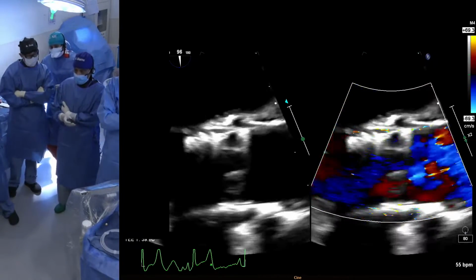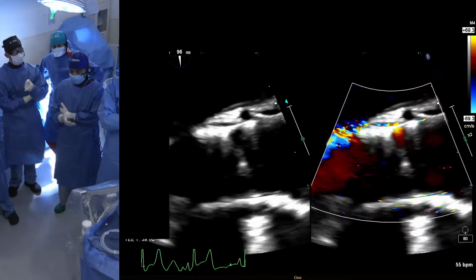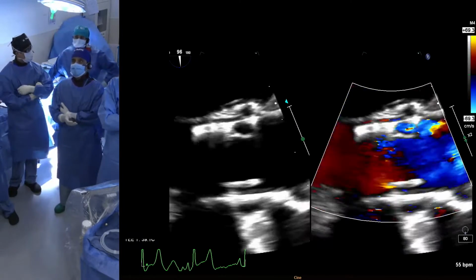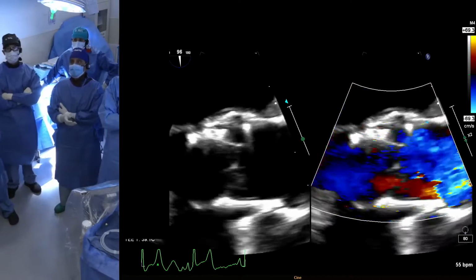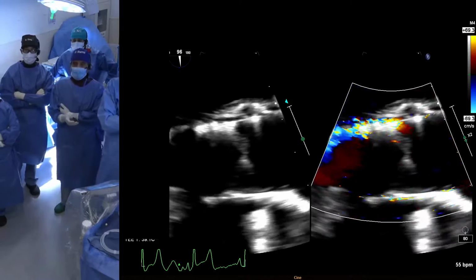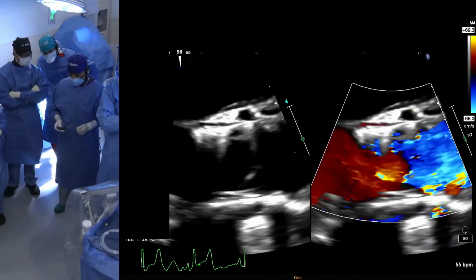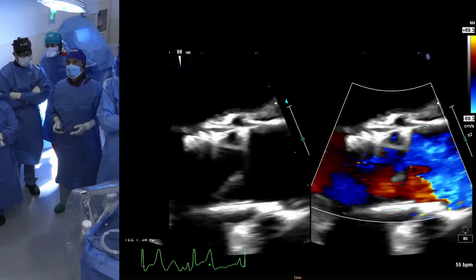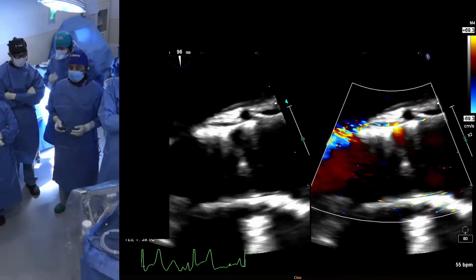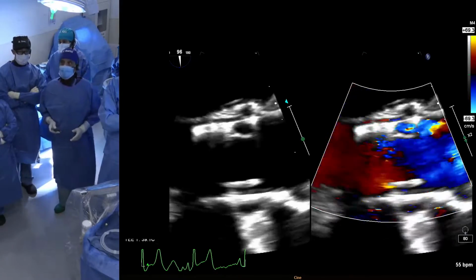Yeah, that's true. And the patient is actually more progressively symptomatic despite improvement in LVEF. And we'll show you on the CT that the LVOT was in fact a little smaller. It's still big, but actually smaller than the baseline that we got. So, very good discussion, Pedro, as you saw, a challenging case. Somebody who comes back. This is also the point, Dr. Sharma, when we are dealing with young patients, 67, 72, 74, and lifelong management. Remember, we are talking about the proper placement of the valve and the proper selection of the valve. I think this falls into that.